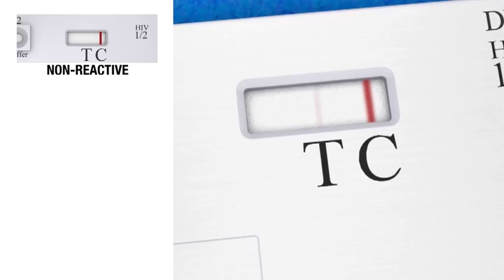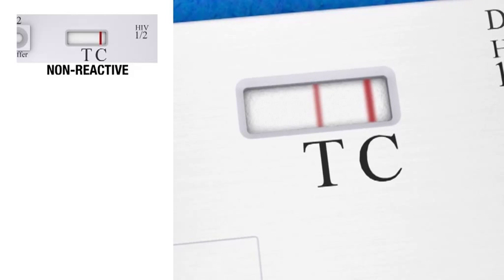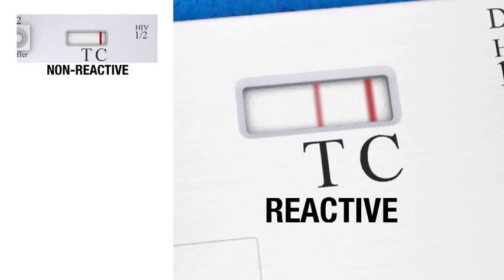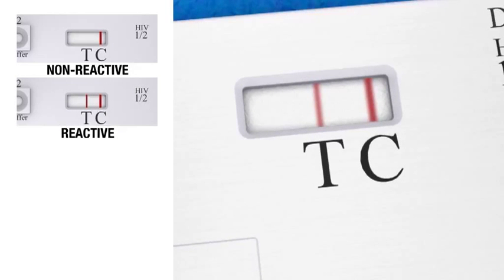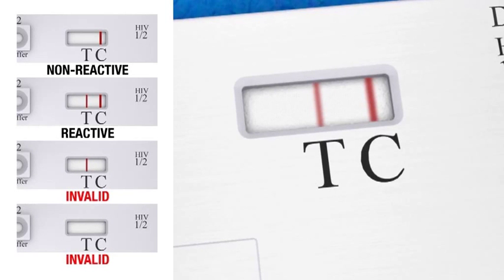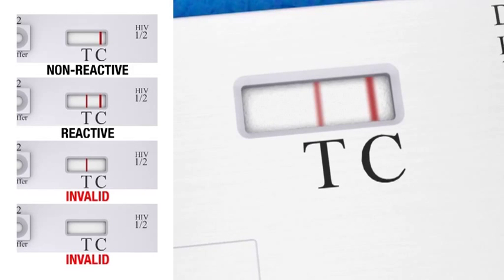If a reddish line is visible above the T marking and a line is visible above the C marking in the test window, then the result is reactive, meaning that the patient is preliminarily positive for HIV-1 and or HIV-2 antibodies. The results must then be confirmed by a more accurate method.